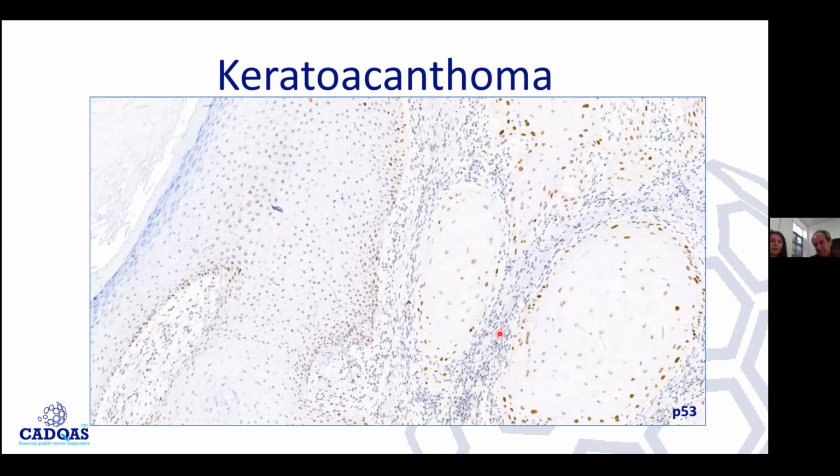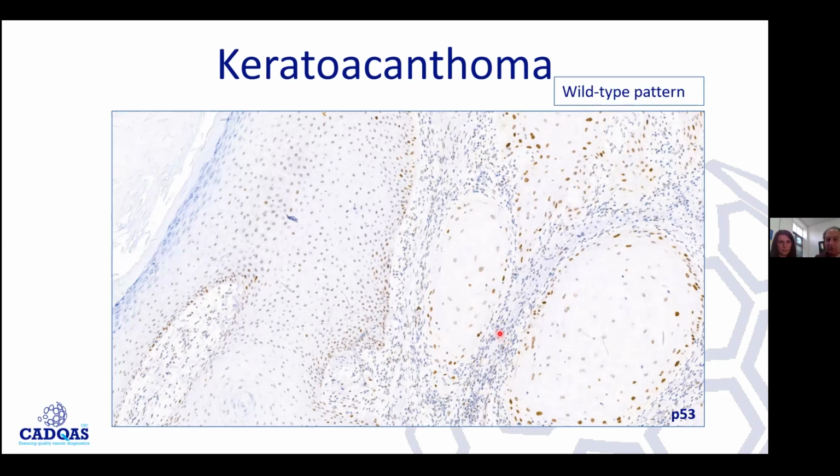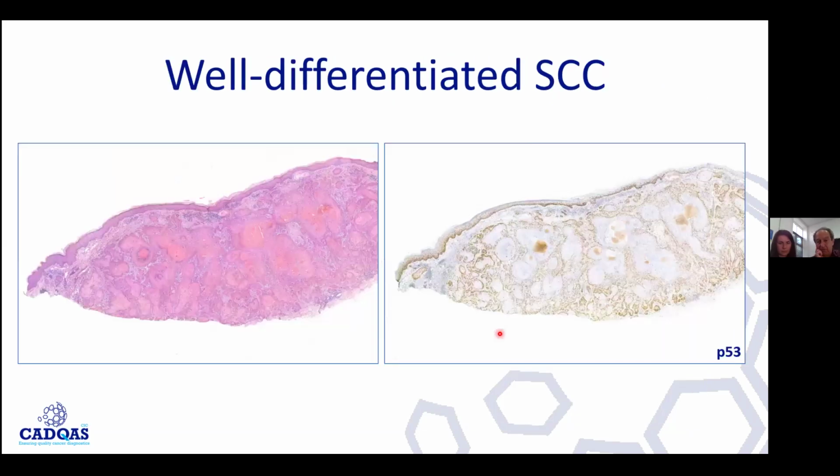Personally, it doesn't. But if you find the P53 mutation, then you have it in mind, I don't know if this is P53 mutation associated with a proliferative or more florid keratoacanthoma, or this is some evolving thing. You could have P53 mutation in keratoacanthoma, but if you find P53 mutation together with other parameters, you feel maybe I should veer towards squamous cell carcinoma rather than keratoacanthoma. But if you find absence of mutation, which is less common in squamous cell carcinoma, maybe you are steering towards keratoacanthoma in the correct setting.